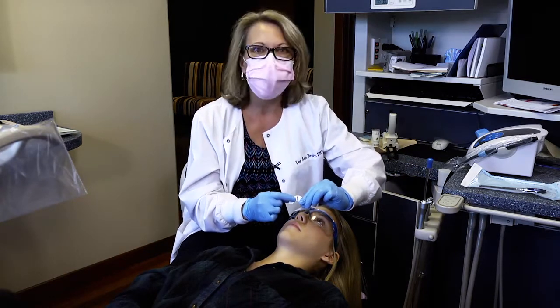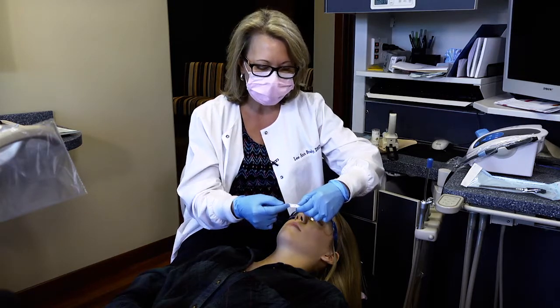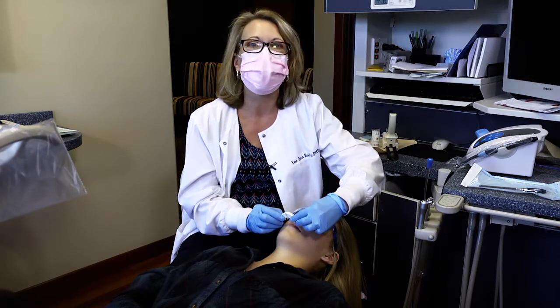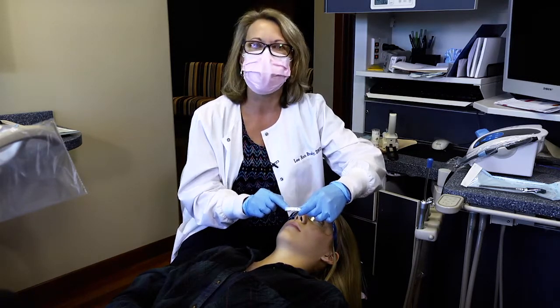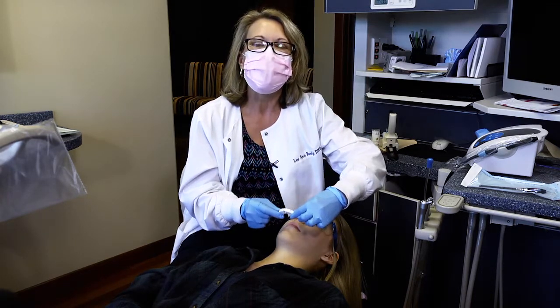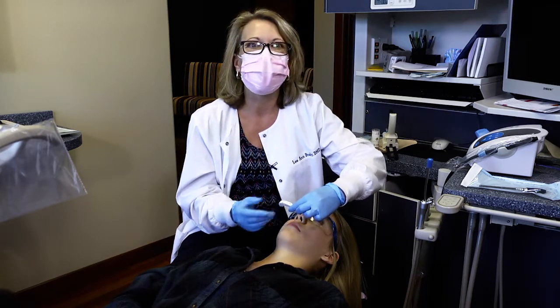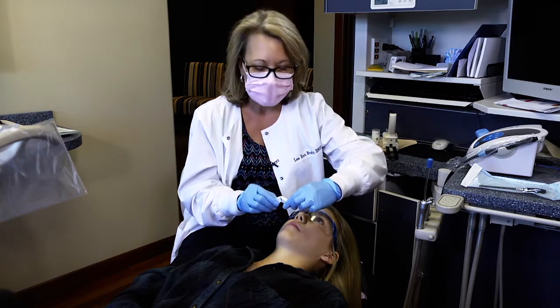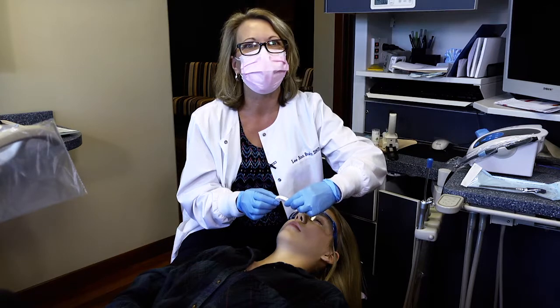I actually do want this little slit at her midline. I also want to make sure this anterior flange of my QuickSplint is as close to the labial of her upper teeth as I can get it without it actually touching her teeth. I actually do need some of the bite registration material on that labial, so I'm getting a sense of how I can position it. And then the last thing for me is when I ask Jenna to bite, so she's practicing what I'm going to ask her to do, I'm also seeing how do her lower teeth come in contact with the QuickSplint.